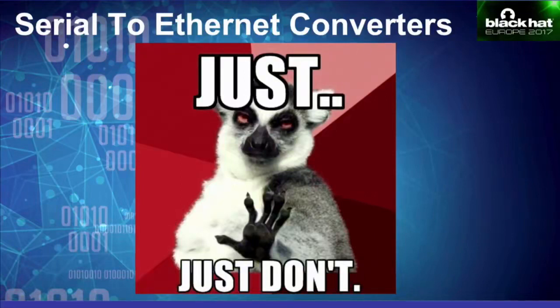Some of you might remember that in 2015 there was a large attack on Ukraine's electrical infrastructure. There was an unscheduled power outage. As per the Department of Homeland Security, the attackers were able to remotely corrupt the firmware of one of these serial to Ethernet converters, which caused the outage. So generally it's always a bad idea to use these devices. And if you really must, make sure that you secure and lock down the whole infrastructure.